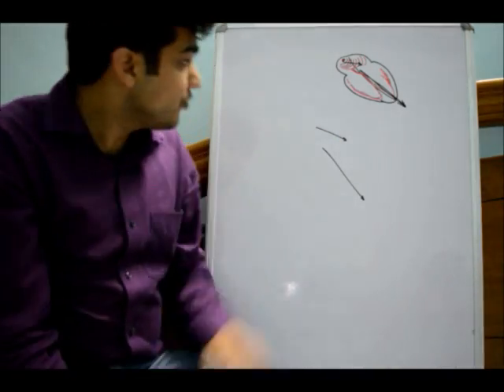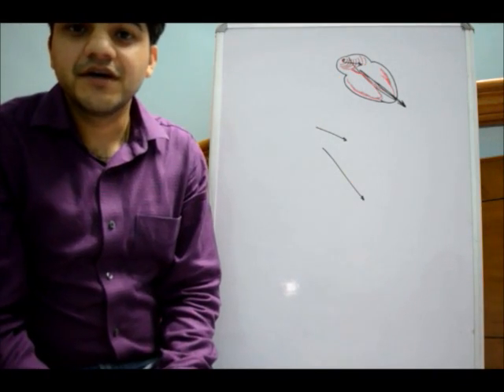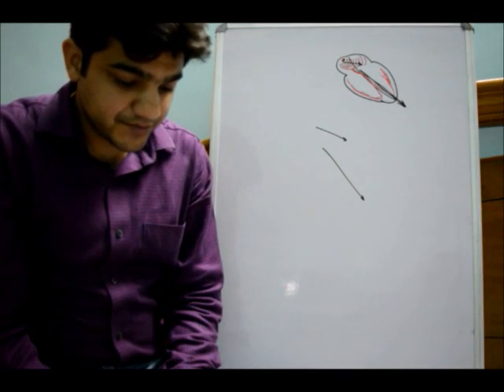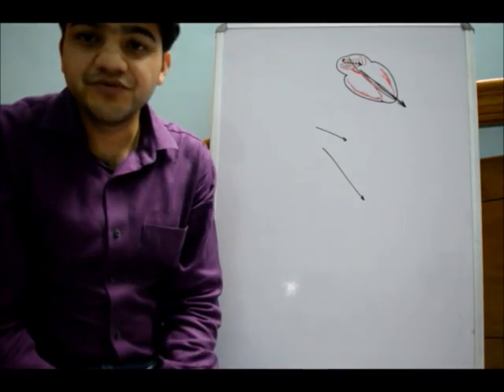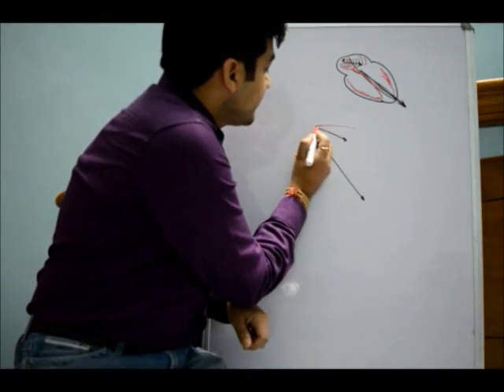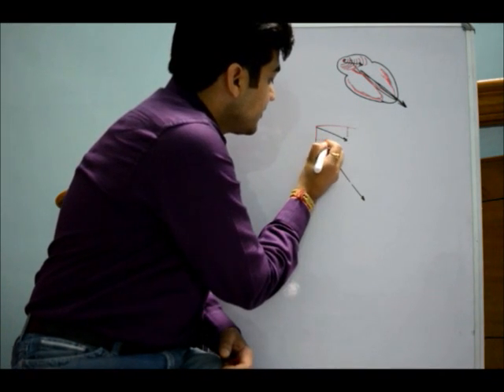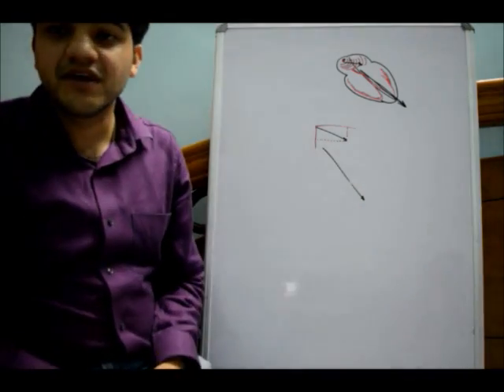Okay, so these vectors are actually recorded on the ECG by means of leads. And the vectors can be projected onto various axes. If I have a horizontal axis and a vertical axis, I can give projections of this vector on these two axes by just drawing perpendicular lines from the axis to this arrow.